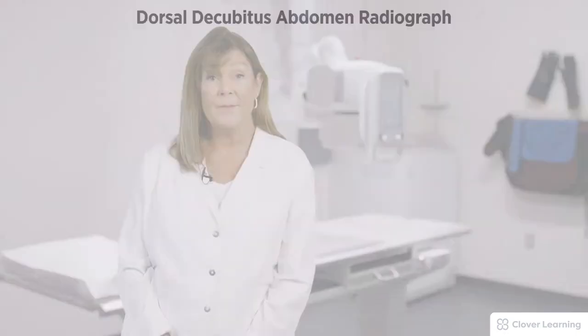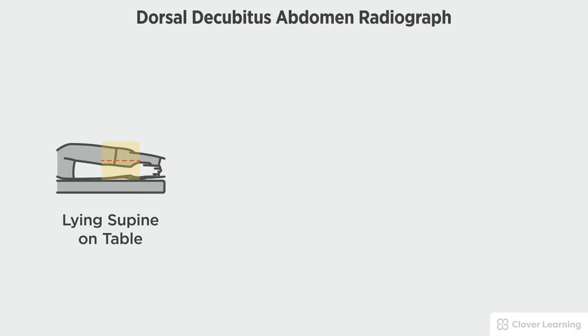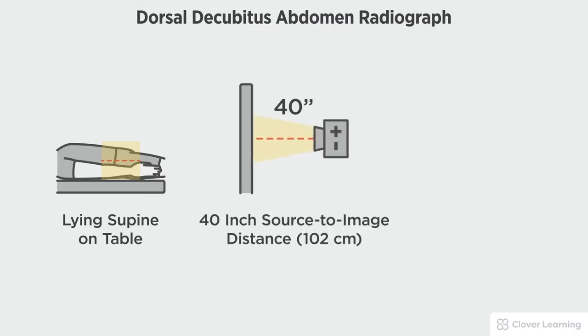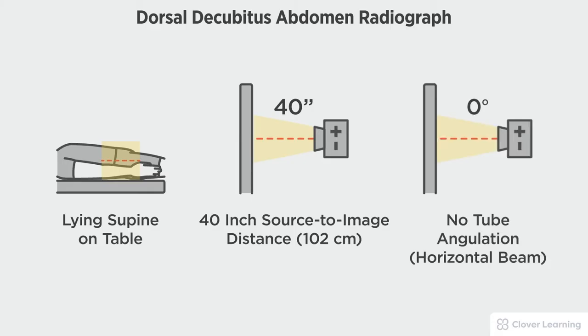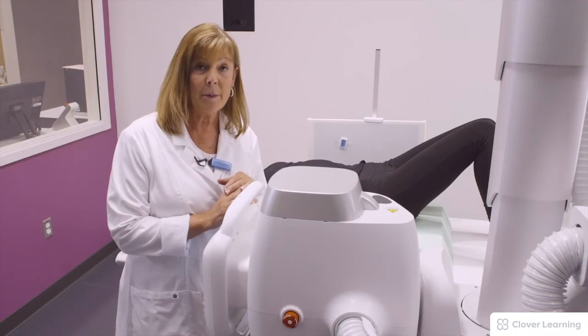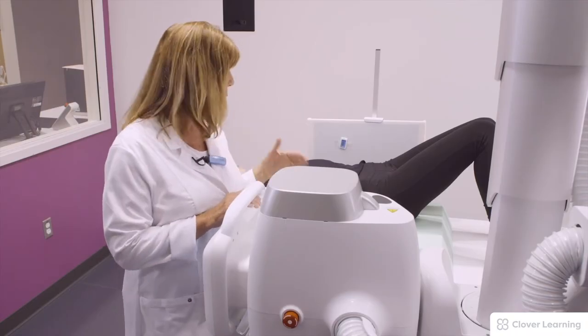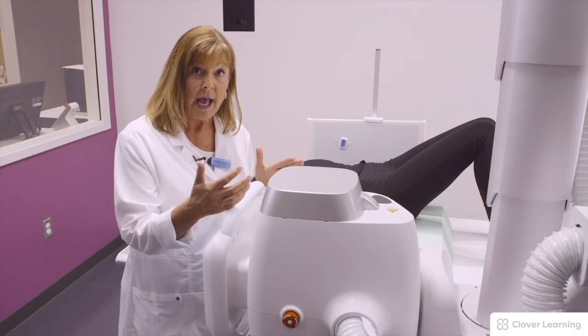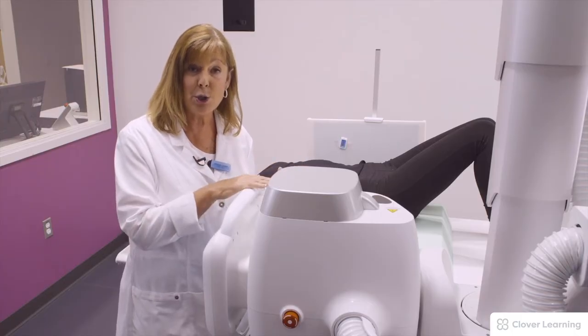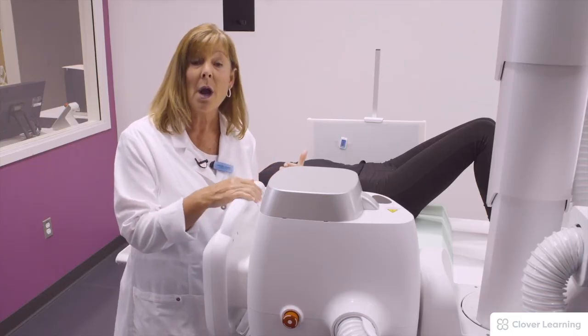In this view we will be demonstrating the dorsal decubitus abdomen. The dorsal decubitus abdomen should be performed with the patient lying supine, a 40-inch source to image distance, and a horizontal beam with no tube angulation. Our patient is on her back, which is supine. We are going to call this dorsal because the x-ray tube is now decubitus, or horizontal.